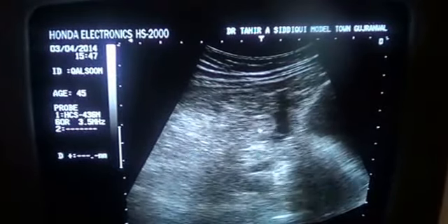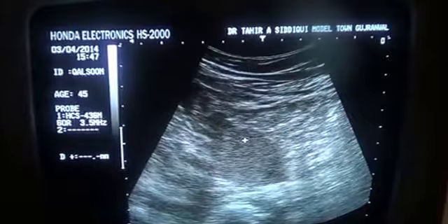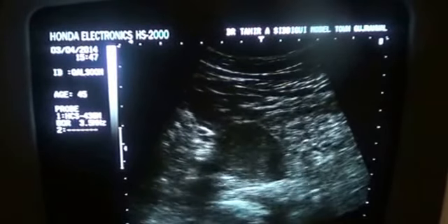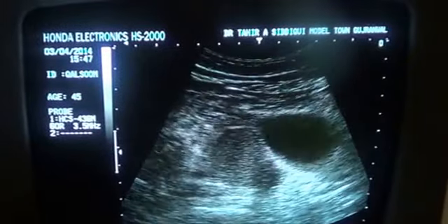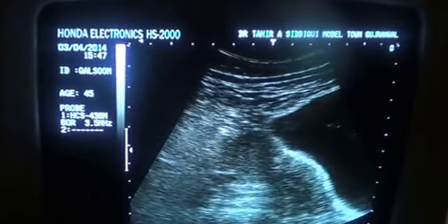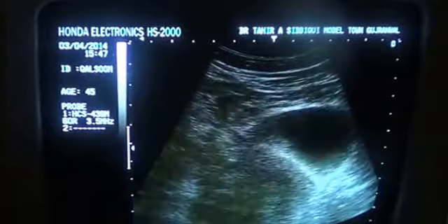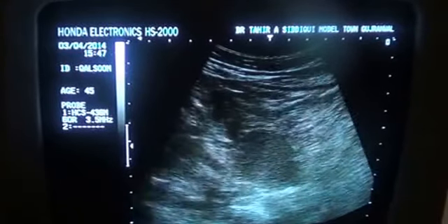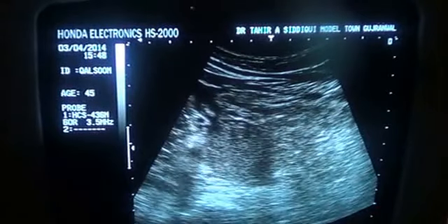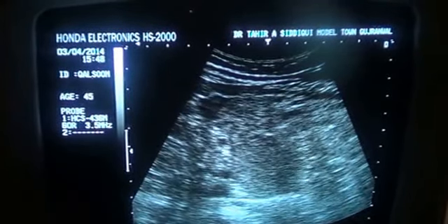These are the bowel segments. And not only that, in transverse section, there comes a solid echogenic area in view, with iliac vessels coursing posterior to it. These are the iliac vessels, internal iliac vessels, and this is the solid echogenic mass, with fluid around.